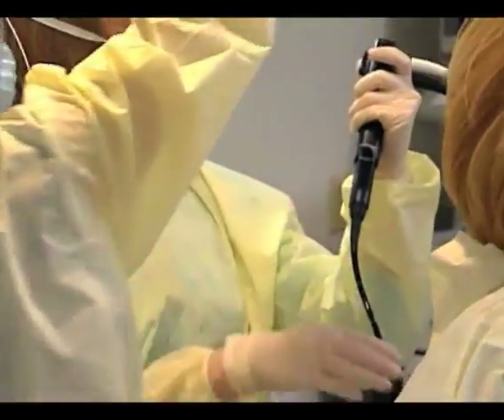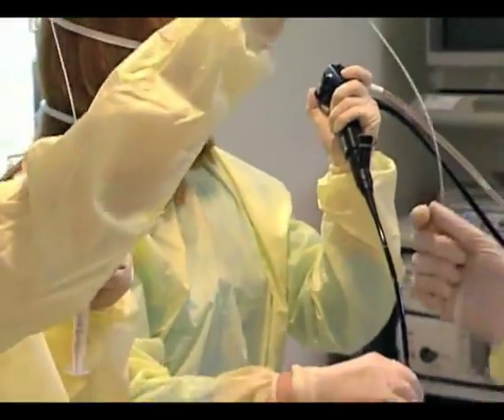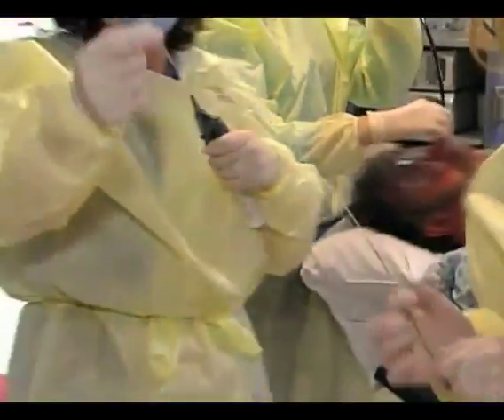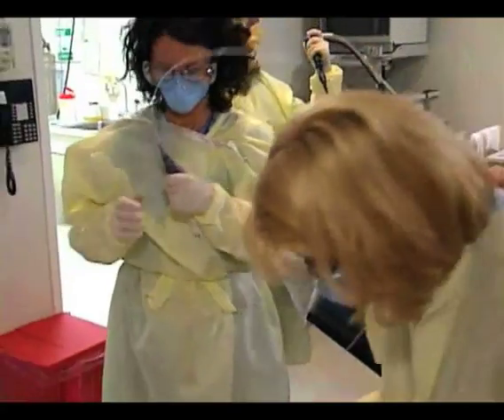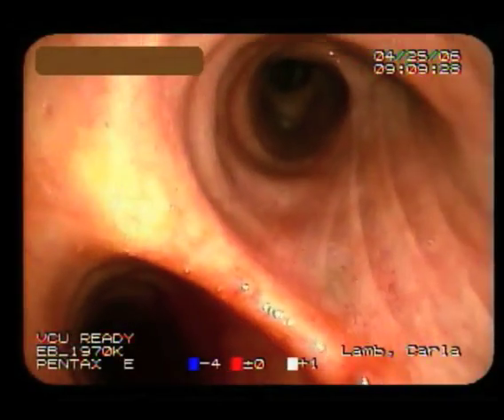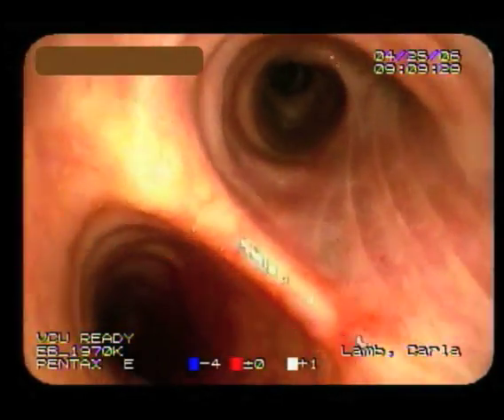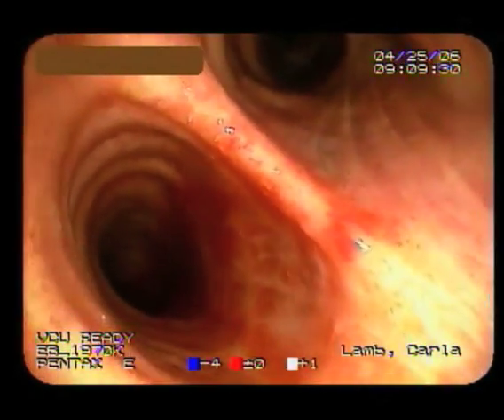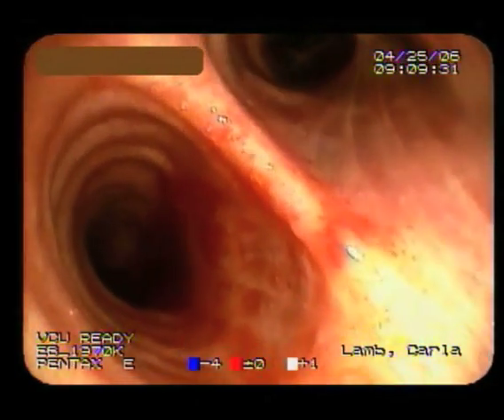We'll do a final inspection of the areas we've biopsied. Hemostasis has been achieved, and we've completed the procedure.